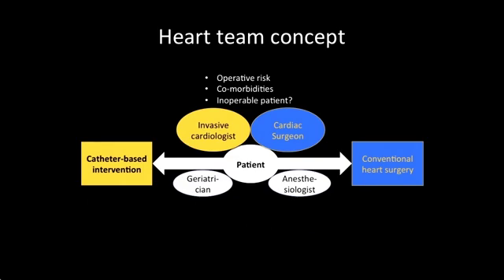The heart team mainly consists of an invasive cardiologist with expertise in TAVI implantation and a cardiac surgeon, but other clinicians involved in the management of patients with severe aortic stenosis are key partners, including cardiac anesthesiologist and geriatrician. As the TAVI procedure is a recognized treatment option for inoperable or high surgical risk patients with symptomatic aortic stenosis, the selection of the final treatment is essentially based on surgical risk assessment and criteria of inoperability.